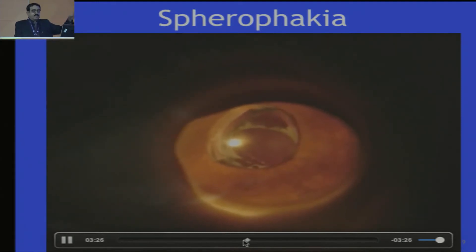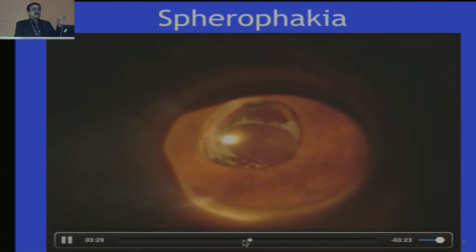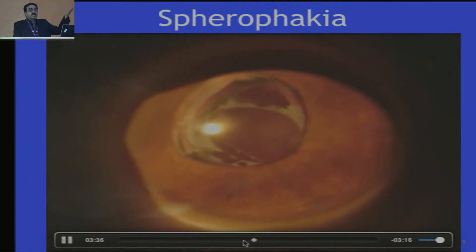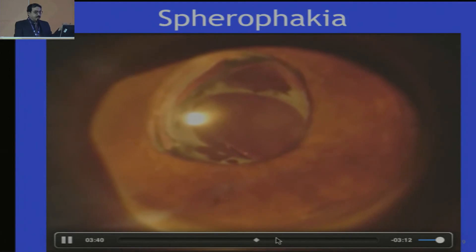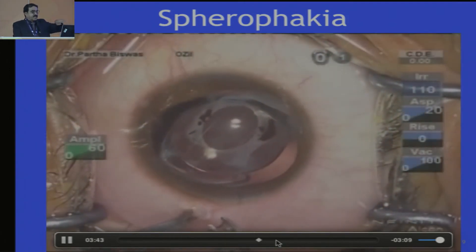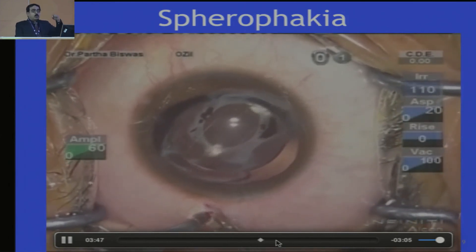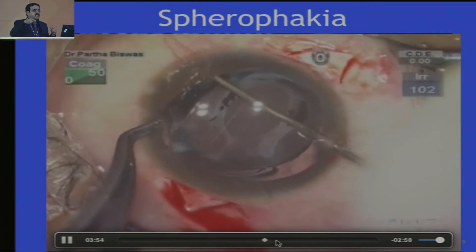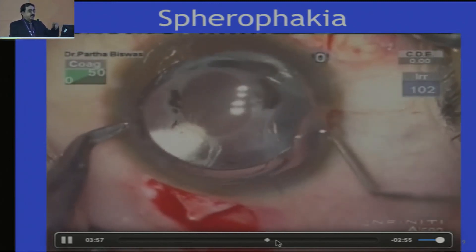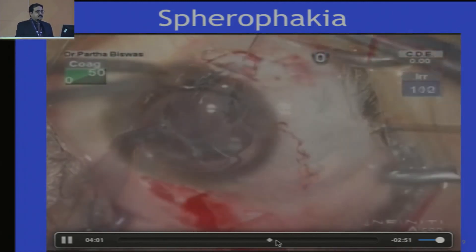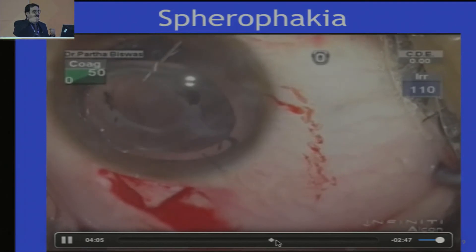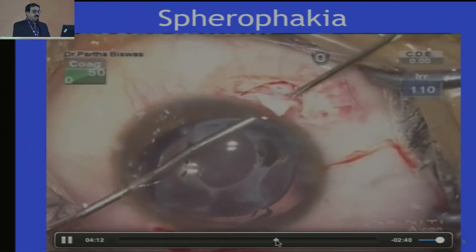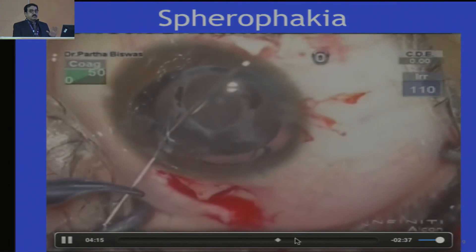My disaster here: I placed the lens and everything went on well, but I did not put in the segments. After four months, this is what I had — a disaster. The lens capsular bag was half in the AC. So the patient was taken up and what we did is we separated the synechia. Then we sutured the capsule with the haptic of the lens — it was a single-piece lens and we sutured it off. We are taking off the synechia and we are able to suture the two ends of this fibrotic bag along with the haptic at both ends. After this is done, it usually stays well in place.